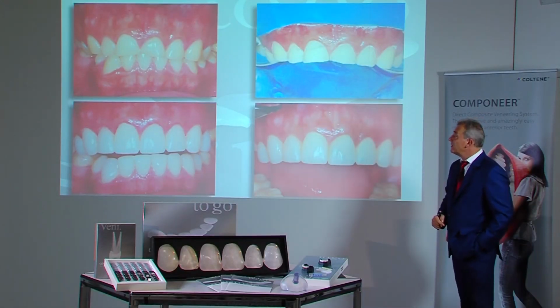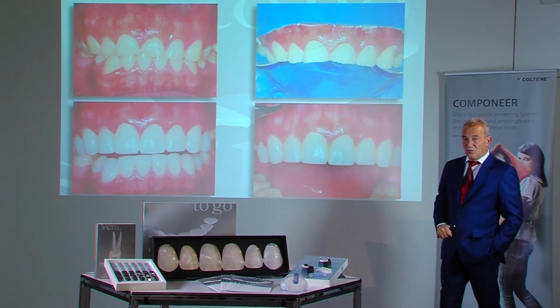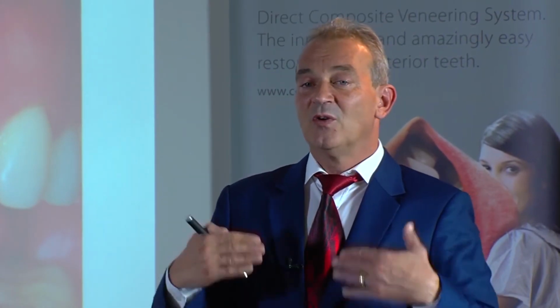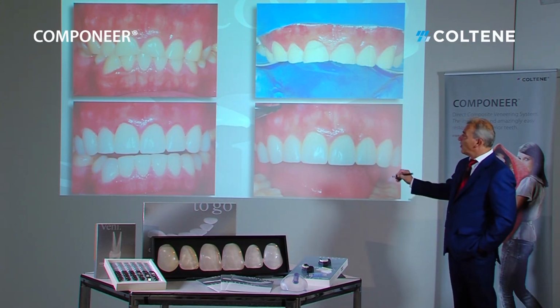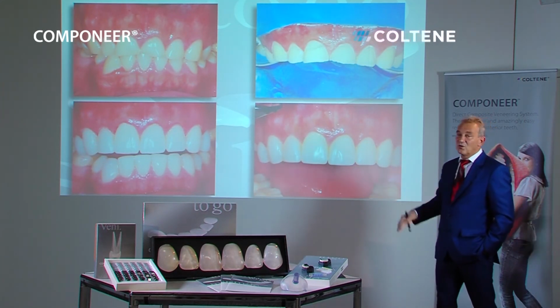There was relatively little palatal layering, as the anterior teeth in the mandible usually result in relative elongation. This means if hard tooth substance is lost, palatal and incisal, the mandible follows suit, curls slightly and attempts to find contact with the anterior teeth. To avoid this, there was only little layering to palatal. The mandible was also restored for the protection of all teeth and to correct the occlusal conditions.